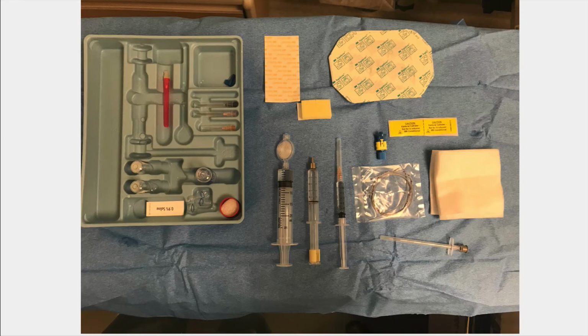Okay, let's talk about the contents of the epidural kit. This is a completely set up and ready to roll epidural kit. The one thing that's missing from this is the patient drape, which should be on the patient by the time your kit looks like this. But every time I placed an epidural, this was my complete setup ready to roll.